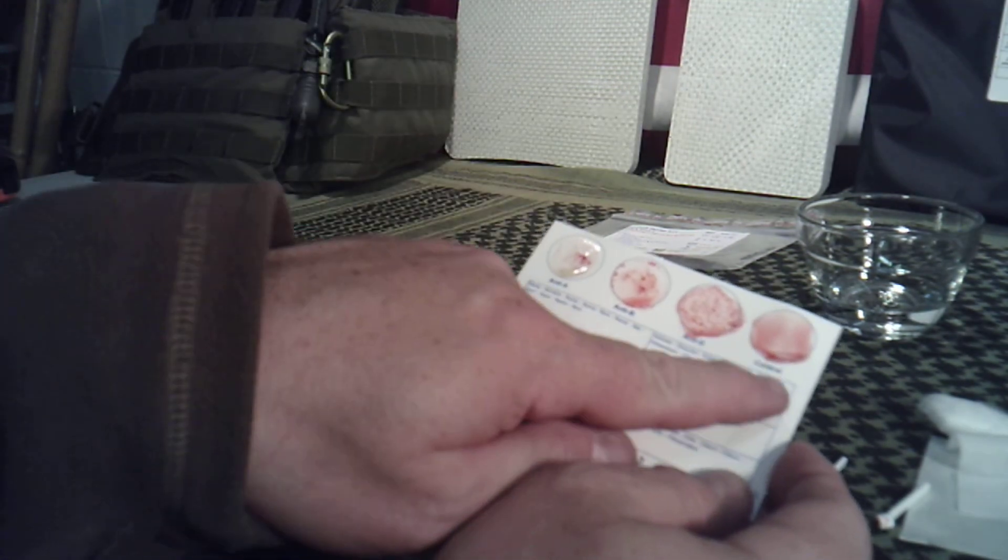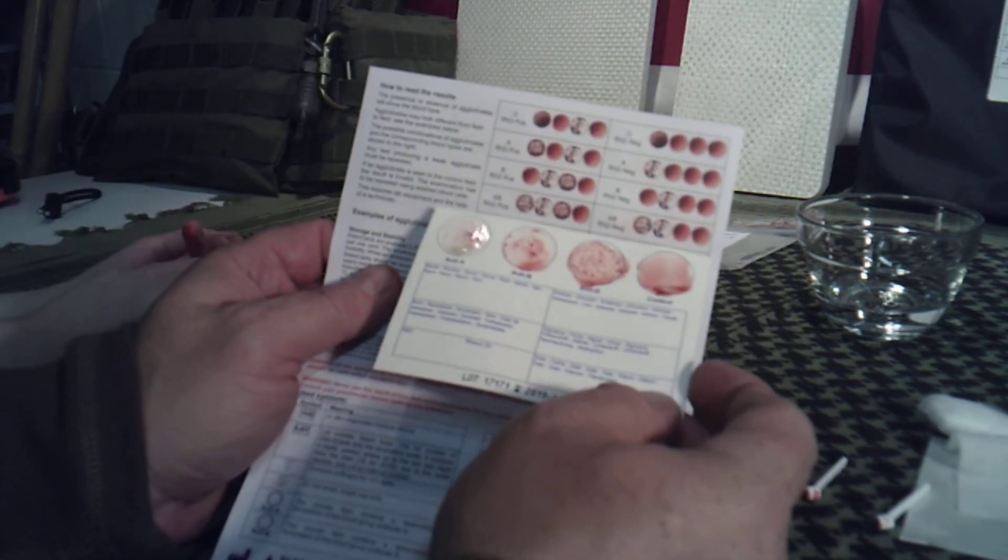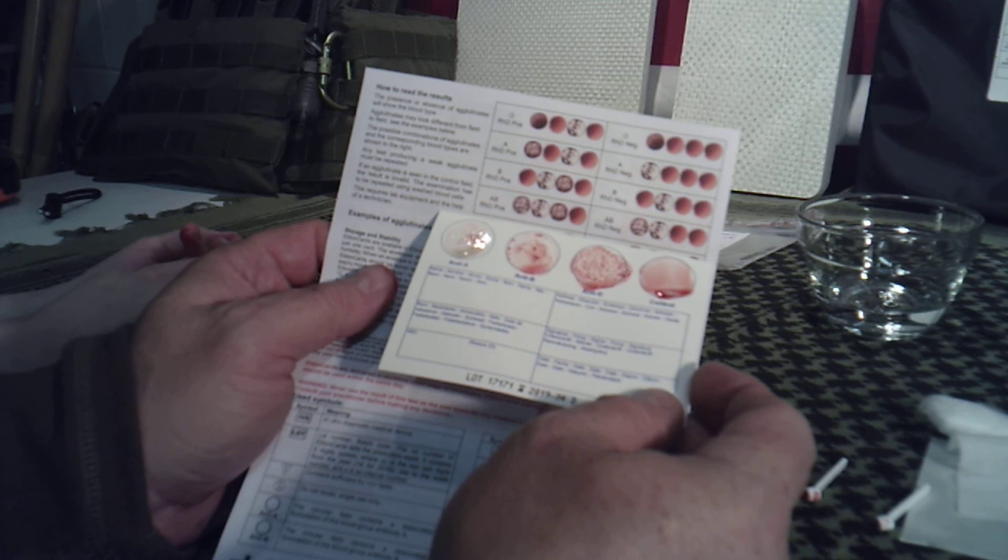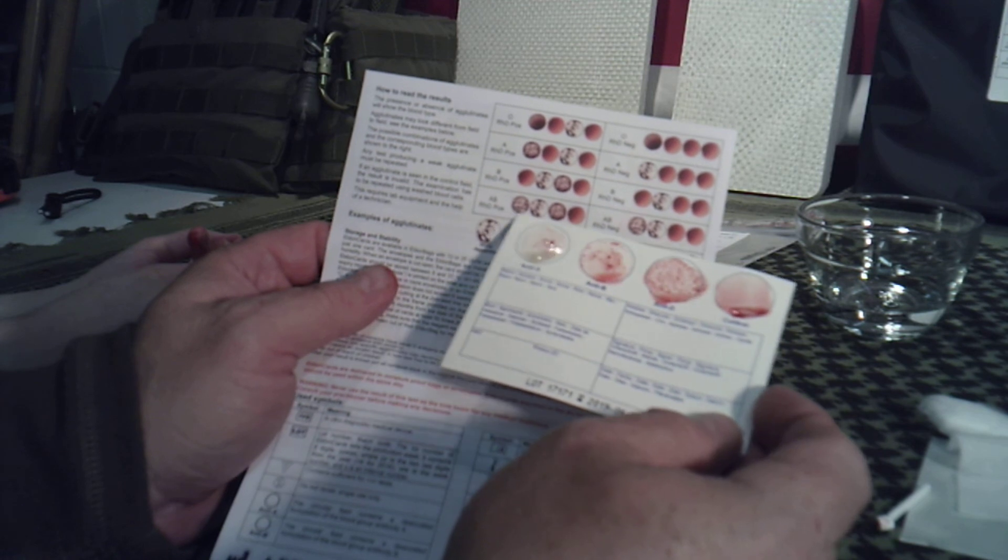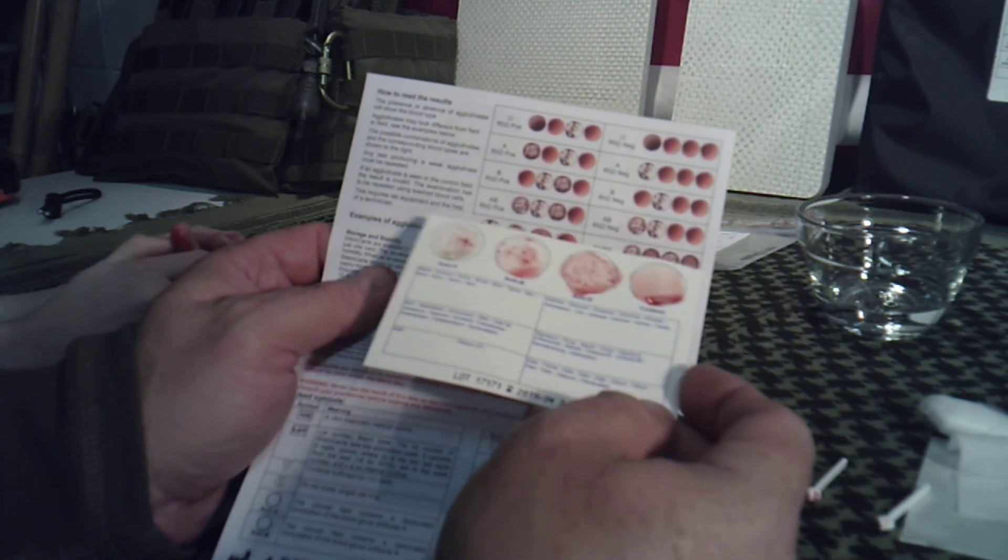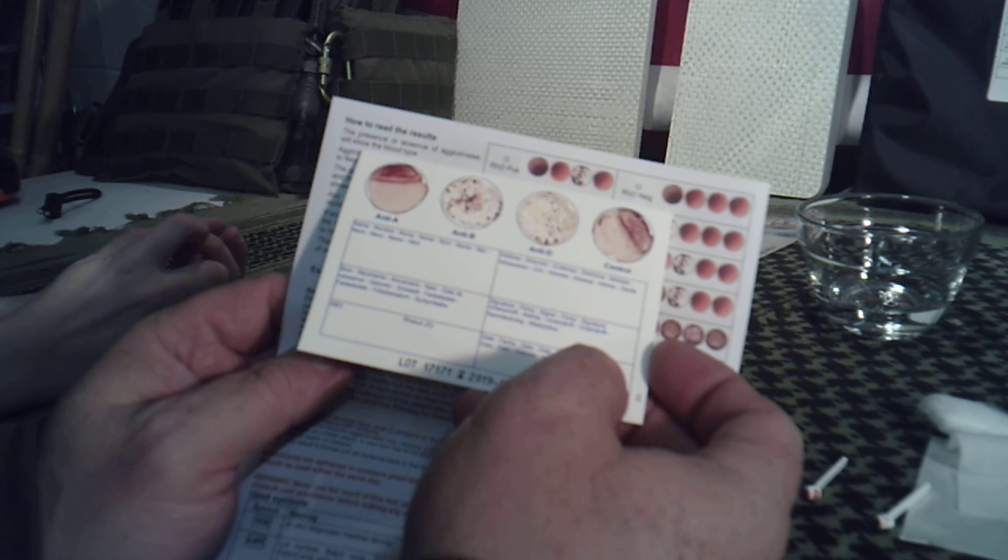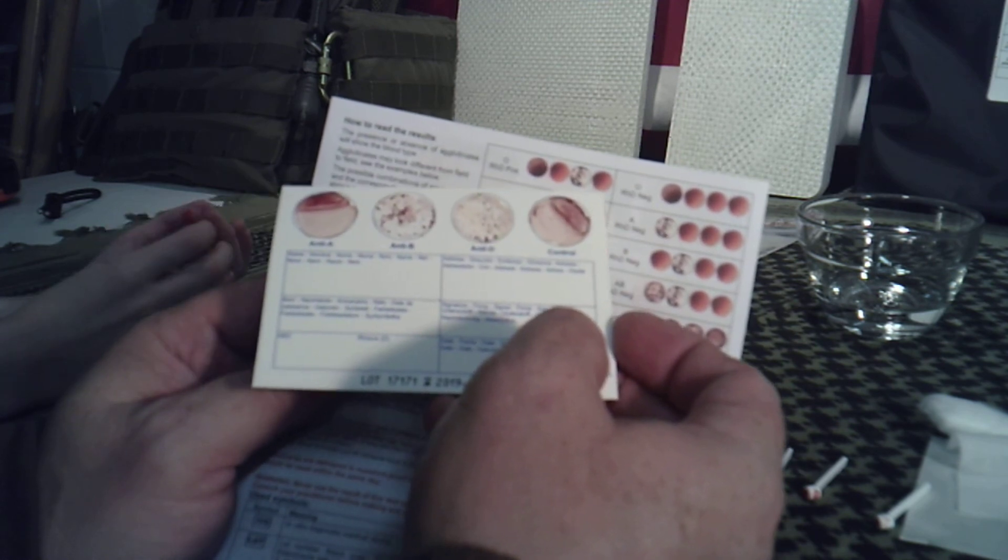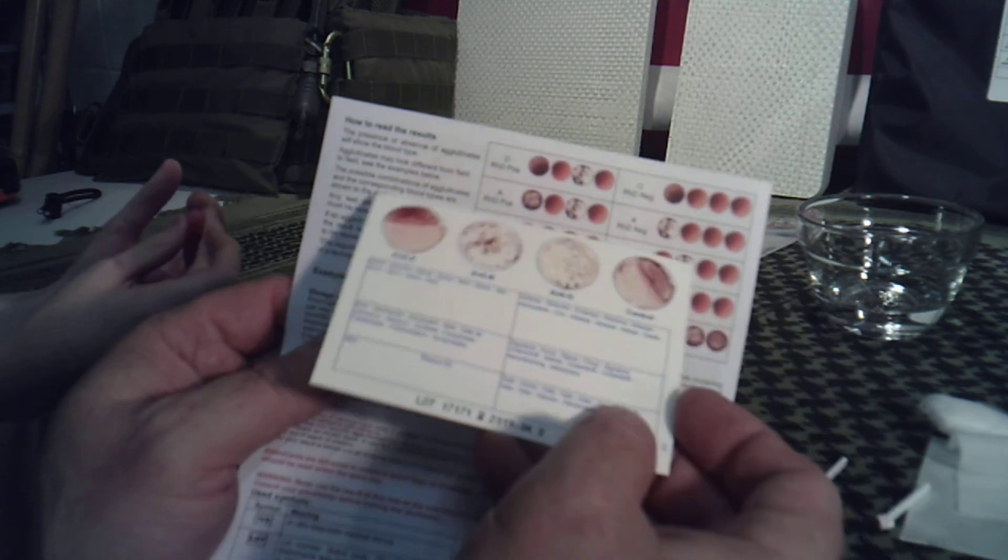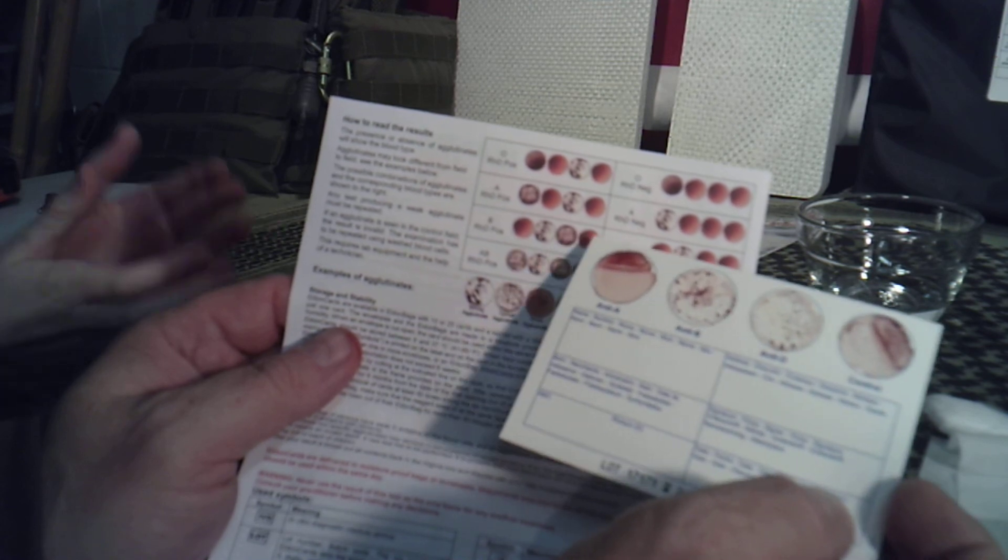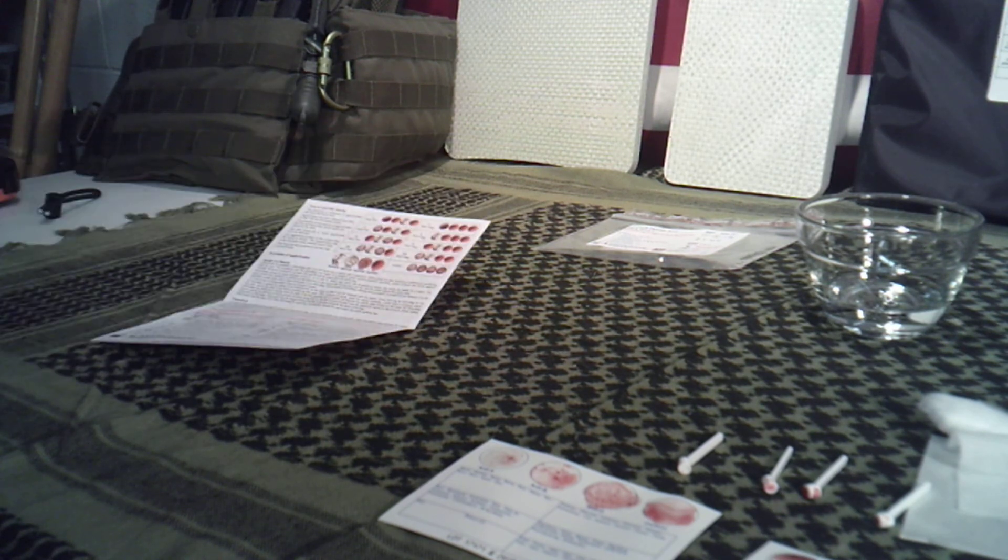On his I can already tell you he has three that are splotchy and then one solid on the end. With his I can already tell you he is AB, is what his blood type is. His has three kind of splotches and one solid, and that means his is AB. Mine, if you go down there's O, A doesn't match, then splotchy solid splotchy solid doesn't match, solid splotchy splotchy solid and there it matches.